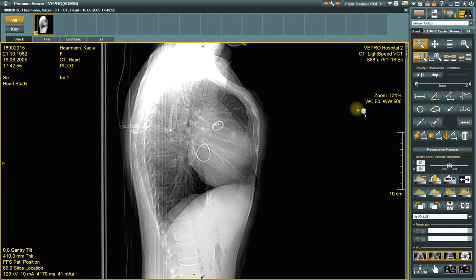For each hanging protocol, you will first need to define parameters that describe the image group precisely. This can include, for example, specific information from so-called DICOM tags, but also other image description fields from the vPro database.